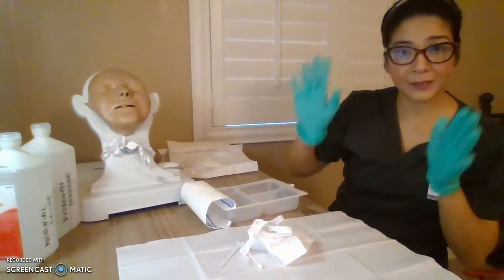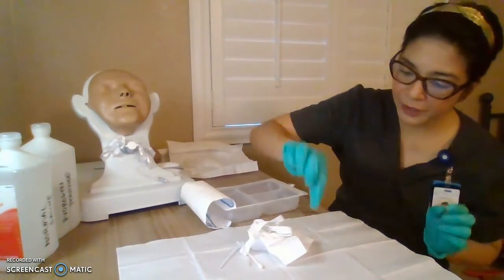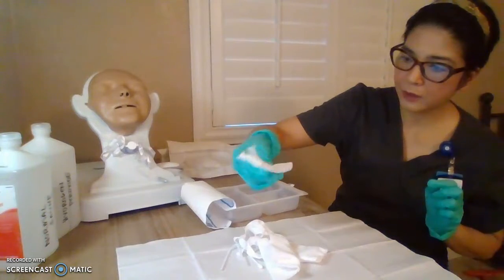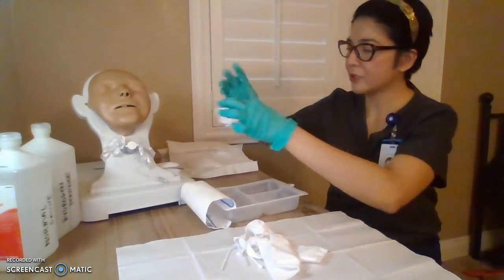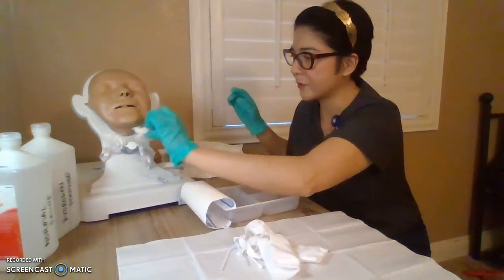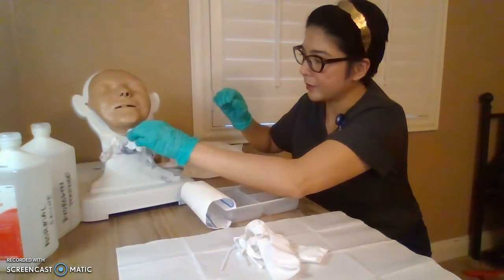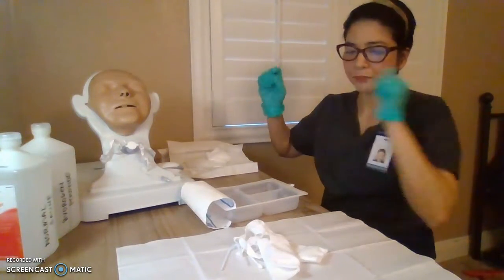So now, this one is very important. Now we have to dry that area. Okay, so we have to look for your 4x4 gauze, okay, dry, and now we are drying this area, slowly. All right, there you go, slowly drying, drop.